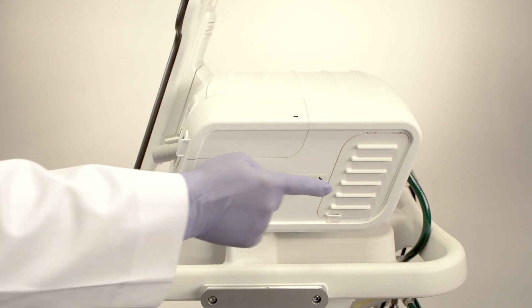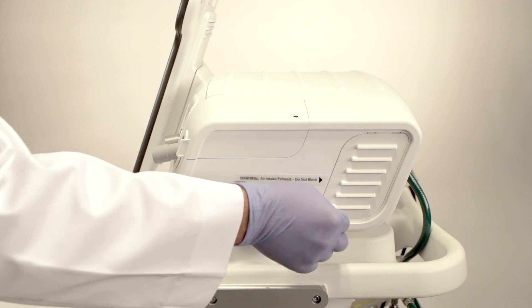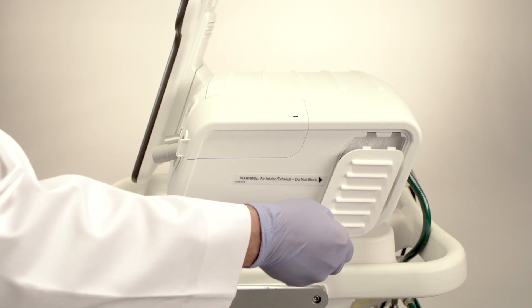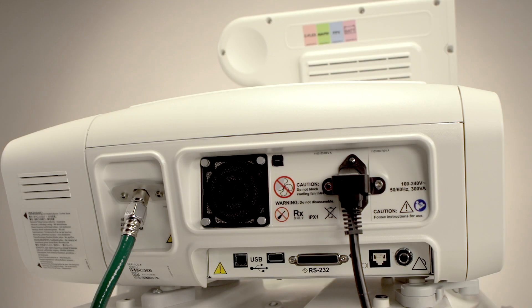Turning the unit 90 degrees so that the right side is facing you, we see the air inlet for the blower. This is filtered for purity, and the filter is easily accessible for inspection and replacement. Simply grasp the tab and lift the magnetized panel to expose the filter.